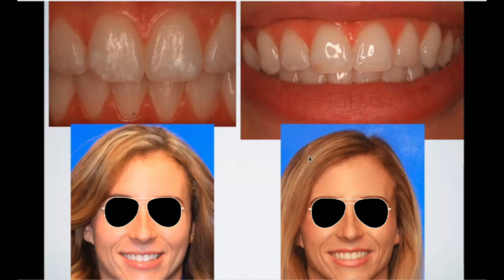So that's why in their protocol, after you do your initial infiltration with the resin and you cure it, you do a second resin infiltration so that it can go into all those areas, hypothetically, that have had that shrinkage, and it can seal those off as well. So you don't want to forget that step so that it'll last.